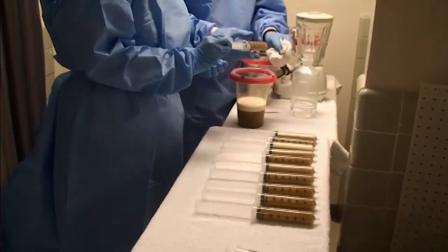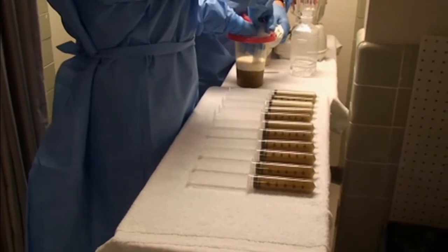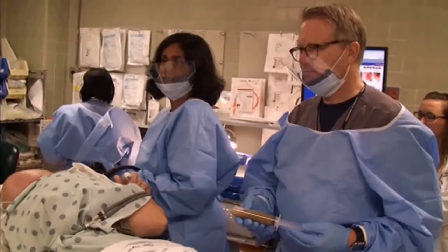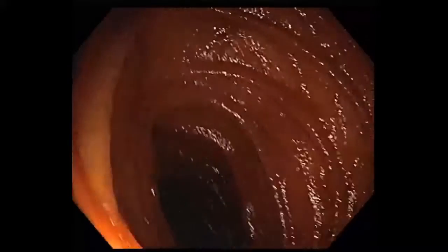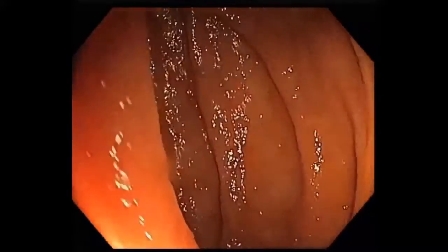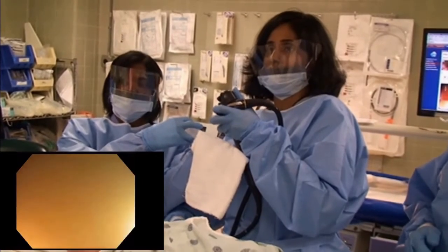The filtration process is now complete, and the donor specimen can be moved from the preparation area to the endoscopy suite. This first patient is having an installation into the proximal small bowel via a pediatric colonoscope. The endoscope is advanced well past the stomach. Here we are in the jejunum, and we take a 60 cc syringe with the donated filtered fecal material and instill it.